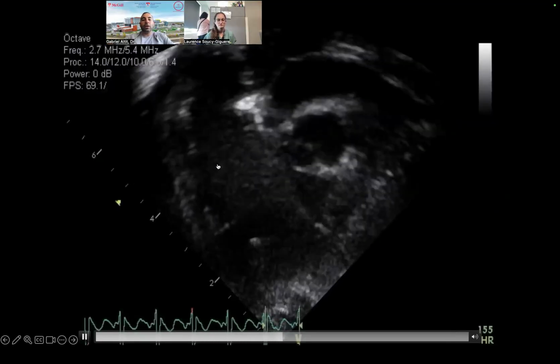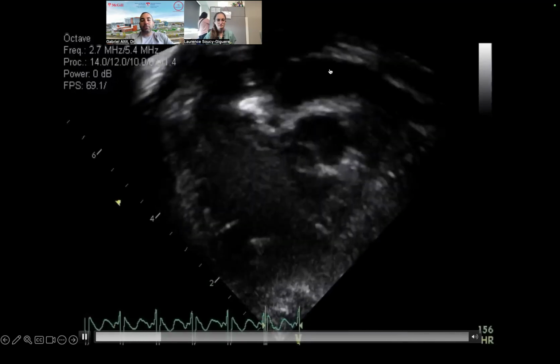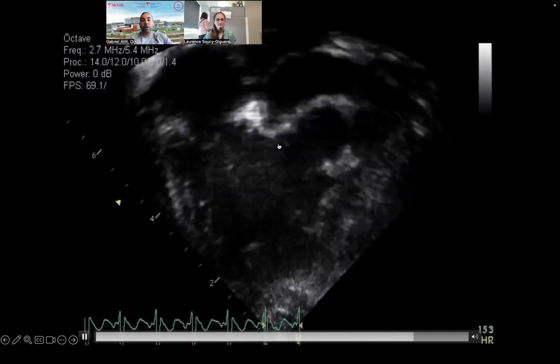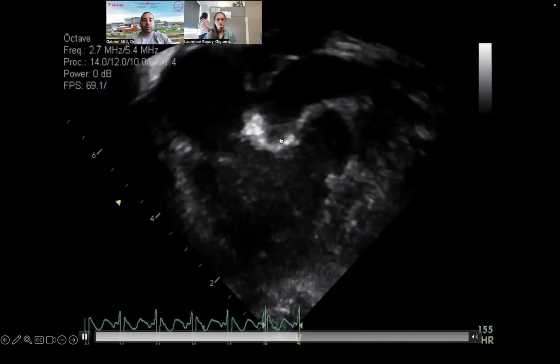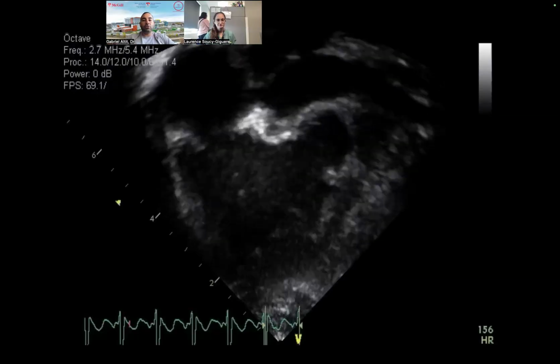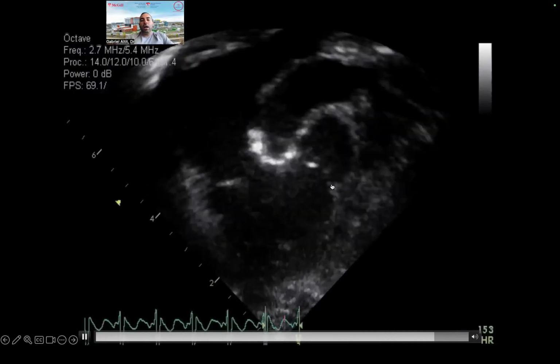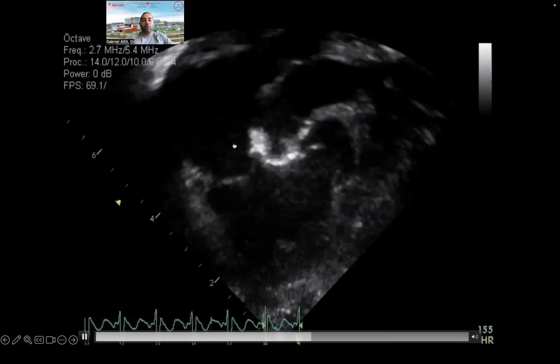So here you have your right ventricle. You see almost your aorta coming back from the background. You see the conus of the infundibulum of your outflow tract with the pulmonary valve opening and closing. So you can see that there's no fibrous continuity, compared to the left-sided portion of the aorta and mitral valve. So the tricuspid valve is not connected to your pulmonary valve. And then you see your anterior wall, your posterior wall, and your inflow portion of your valve.